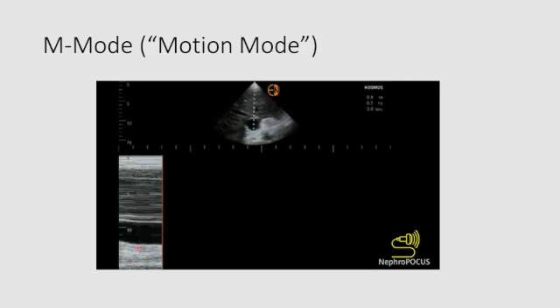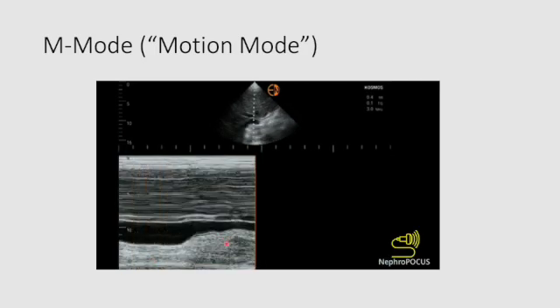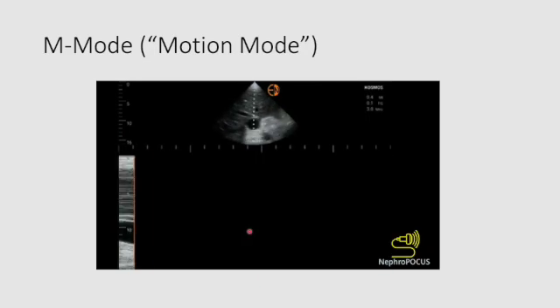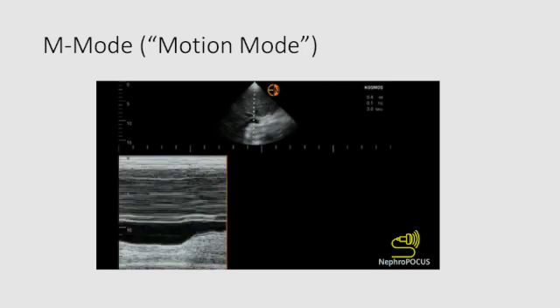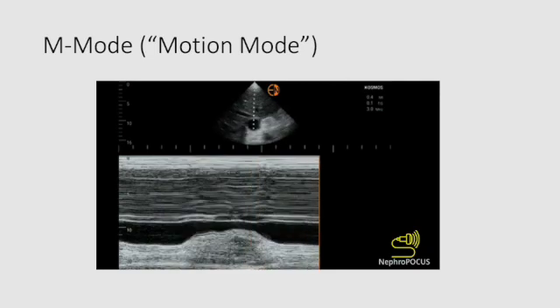We can see that this represents the same portion of tissue as this does, but that at this point in time, that plane of tissue is much closer to this plane, and that's because of that compression. So if this confuses you, I think once you start doing it in real life on a patient, you'll start to intuitively understand it.